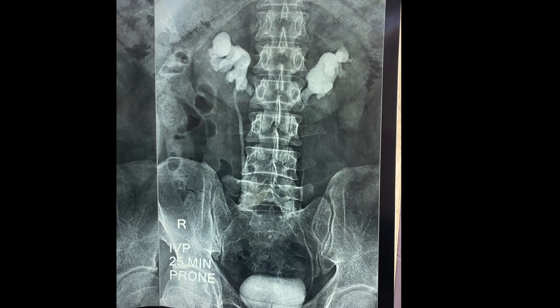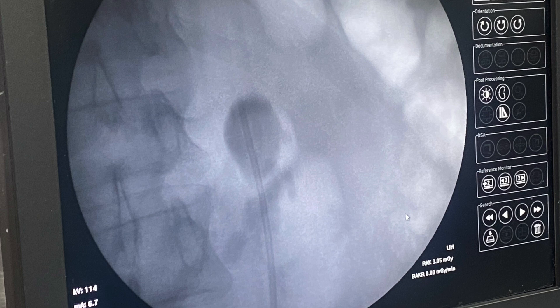The next film is a prone film where you can clearly delineate the ureter on the right side. It is very important to notice that in case of horseshoe kidneys the inferior calyces are medially oriented, which you can clearly notice in this image, and the ureter is generally found lateral to the inferior calyces. This is because of the fusion of the lower poles of the kidney in case of horseshoe kidney.